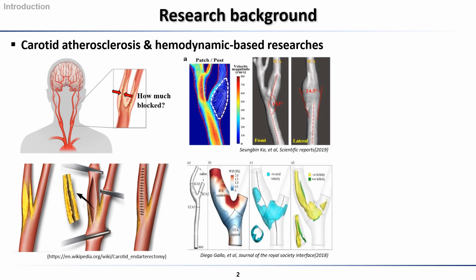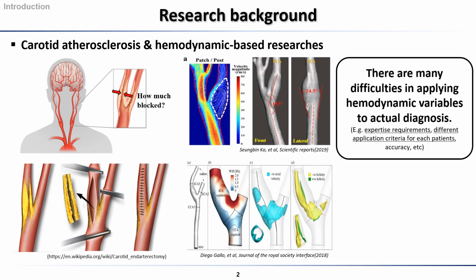Because of this, there is an increasing number of hemodynamic studies that seek to analyze disease from the internal blood flow, away from the morphology. However, although many hemodynamic parameters and association with the disease have been reported, only a very few cases have been used for actual diagnosis.